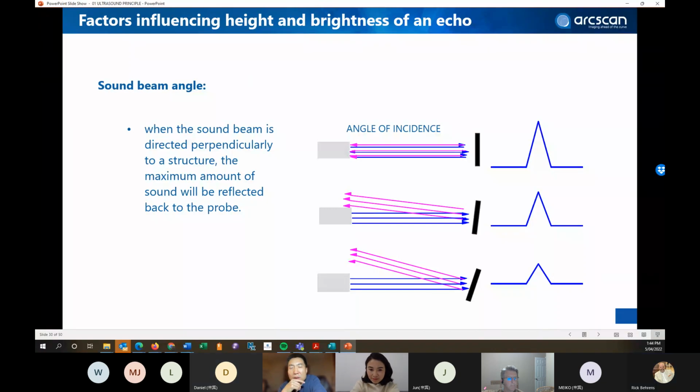So, Rick, this is Roger. There's something we need to be clear about. We received the feedback from NMPA. They ask specifically about frequency, whether we should claim 50 or 40 or 35. So if we claim 50, we have to pass the test at 50 megahertz frequency, right?